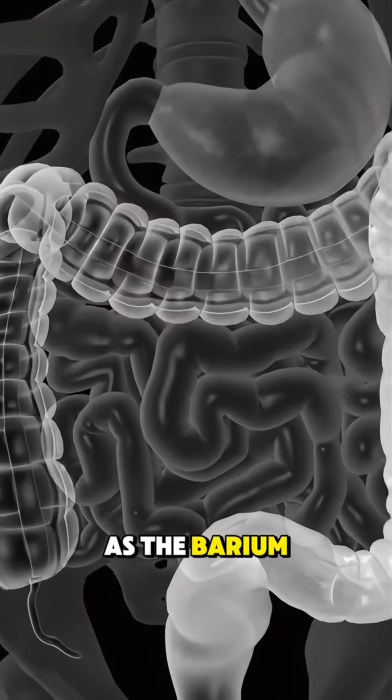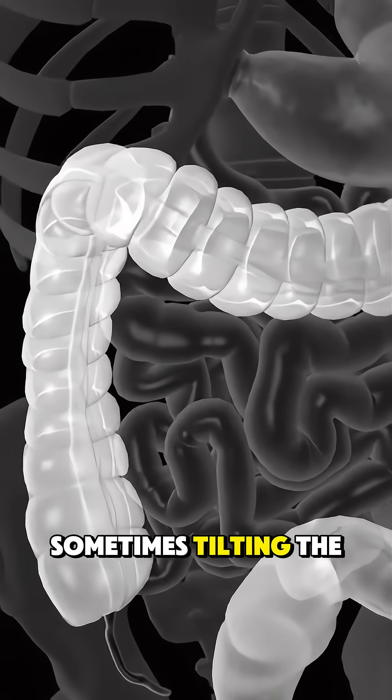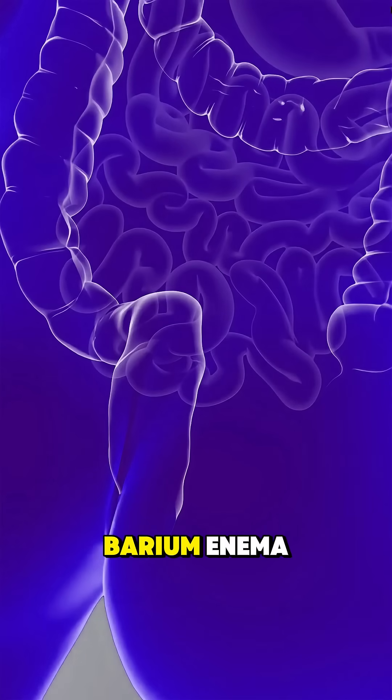As the barium spreads, the technician takes multiple x-ray images, sometimes tilting the table to help the liquid move. In some cases, air may also be introduced to expand the colon for clearer images. This is called a double contrast barium enema.